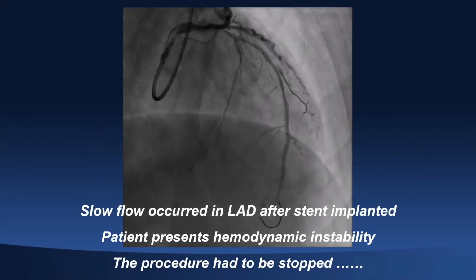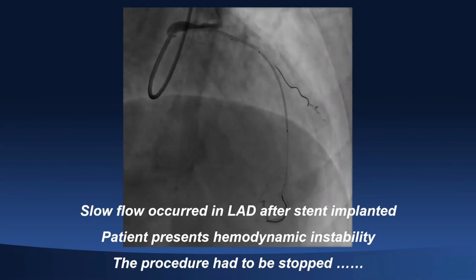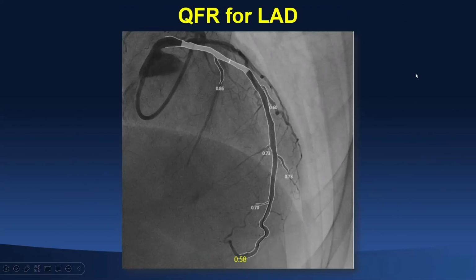Considering the angina symptoms, we calculated the QFR, a novel non-invasive physiology assessment method invented by Chinese scientists, and the LAD is 0.58 and RCA is 0.93. So we could know the LAD causes physiological ischemia and could be treated.